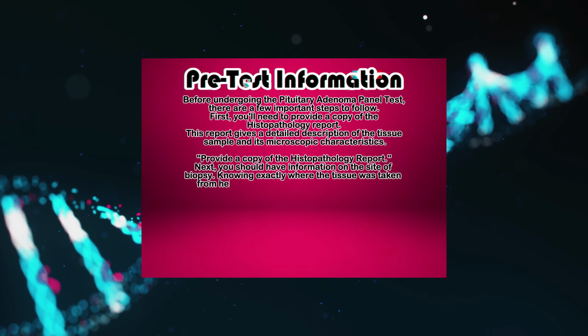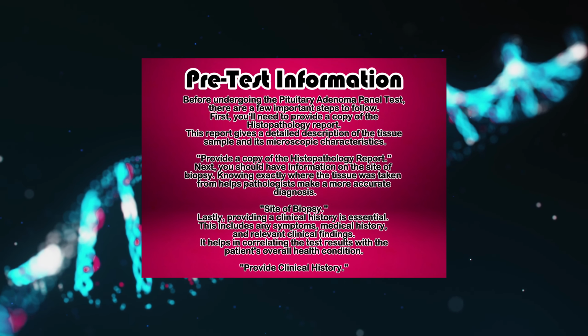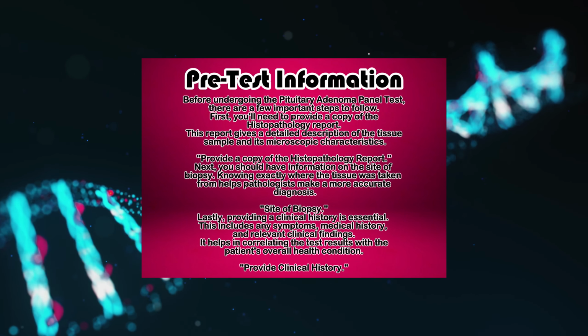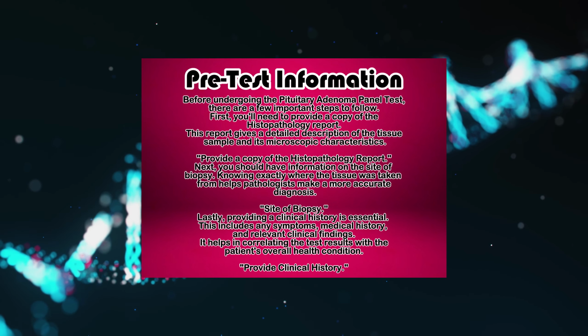Before undergoing the pituitary adenoma panel test, there are a few important steps to follow. First, you'll need to provide a copy of the histopathology report. This report gives a detailed description of the tissue sample and its microscopic characteristics.